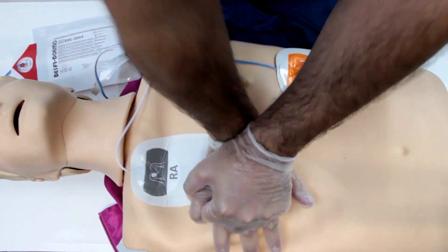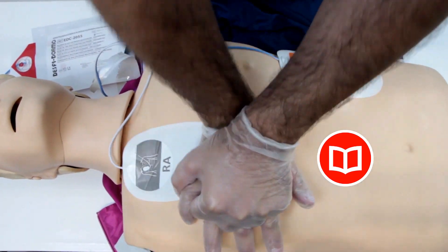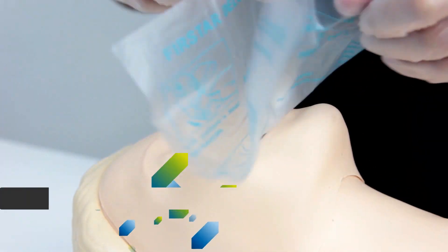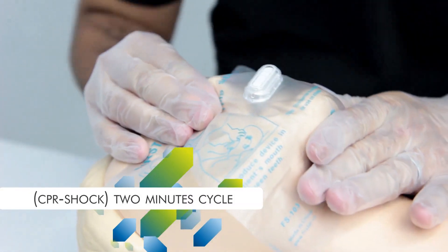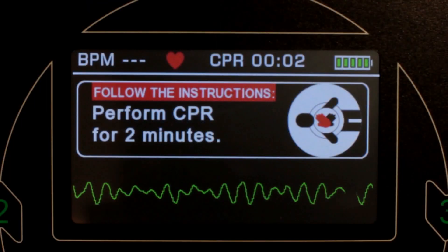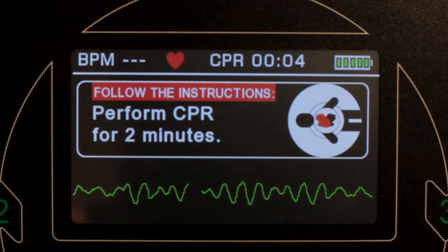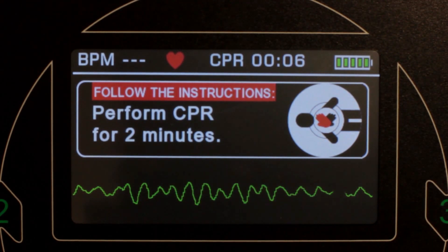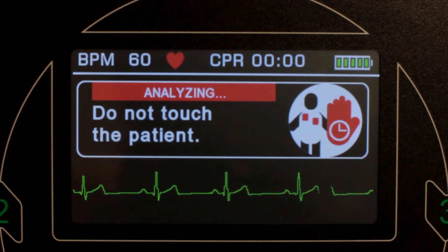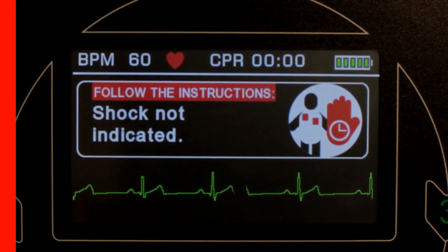Consult the user manual for more information on CPR. Perform the chest compression and artificial respiration cycle for two minutes. Continue to follow the ESIS instructions until the patient begins to move or the emergency service arrives. The ESIS will say 'shock not recommended' should the clinical readings indicate that defibrillation is not recommended.